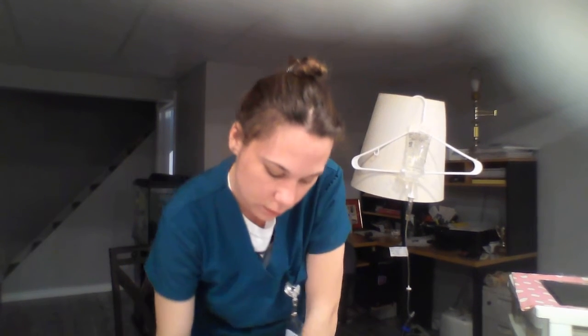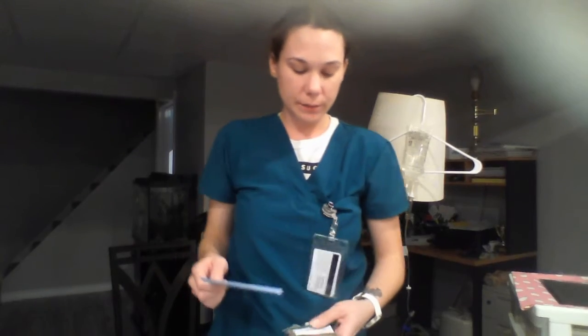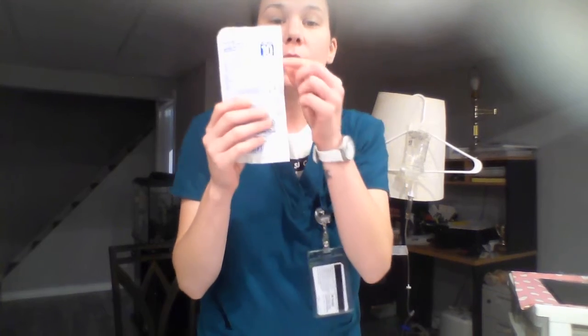150 minutes. Okay. So at this point, I am going to get my teacher to come in and do an independent double check of my IV mini bag, my medication, and my MAR. Then I'm going to do some hand hygiene with my secondary line and my medication. Sorry, I had said the 10 milliliters was on the IV bag. No, it's on the secondary line.